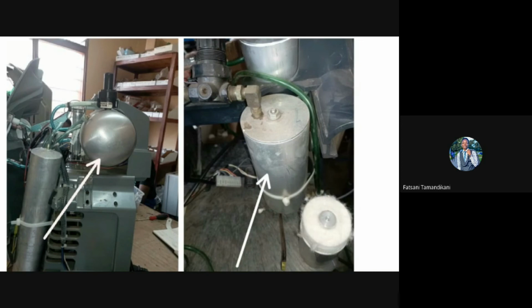This is done in order to give a patient a stable oxygen purity, because it might happen that the two sieve beds are producing different purities of oxygen. And additionally, the product tank also acts as a buffer, as Naomi already pointed out. This is done to level out any pressure variations between the sieve beds.